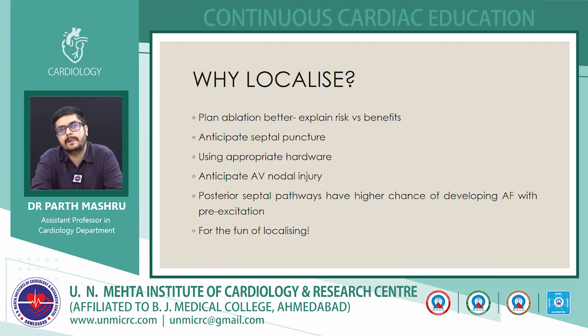For example, if your pre-diagnosis on the ECG is a left sided pathway, you are anticipating septal puncture. So you have to be ready with the appropriate hardware required for septal puncture, and also appropriate counseling to the patient and the relatives that this is how we are going to proceed. So anticipate AV nodal injury that I explained earlier. Another one is, for example, posterior septal pathways, which have higher chances of developing AF with pre-excitation.